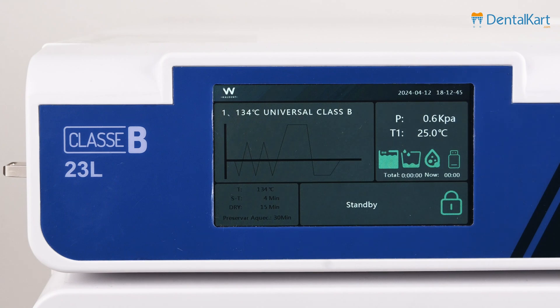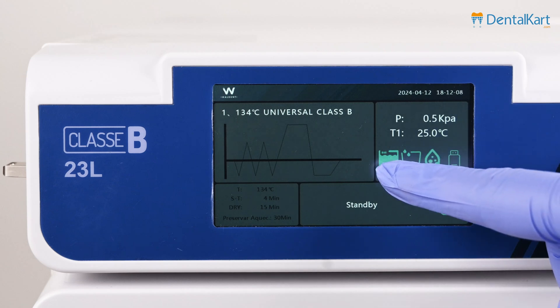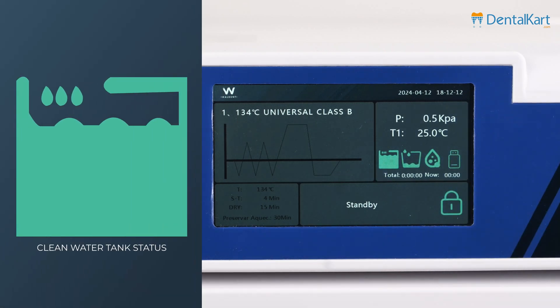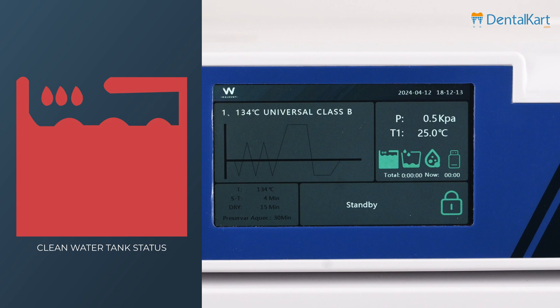We can also see additional icons on the display. The door lock icon is shown here. In the status section, the first icon is the clean water tank status — green indicates the tank is full, and red indicates the tank is empty.